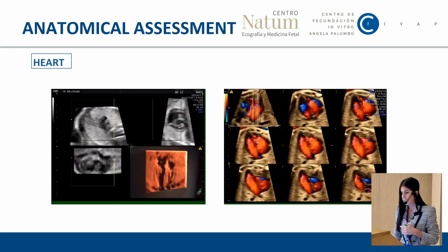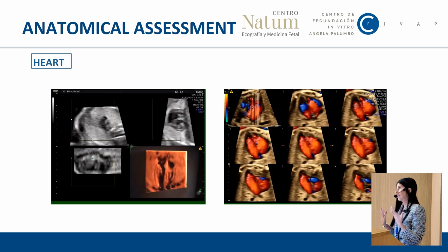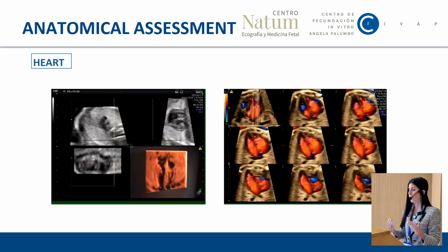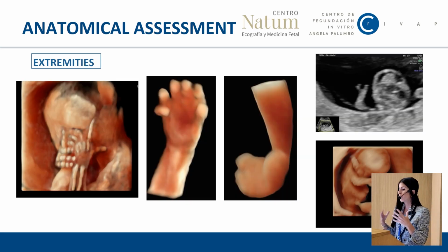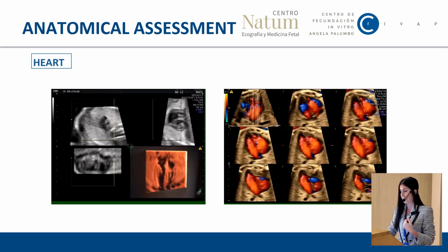The heart as well. Let's see if I can show you. No, the videos of the heart are not working today, but we can see the heart not only in a 3D static picture, but also moving and showing how the blood flows going into and outside the heart. In one of those videos, we were showing a small VSD, ventricular septal defect, where we can show, as the heart is moving, beating, how the blood is going from one ventricle to the other through this small VSD, ventricular septal defect.